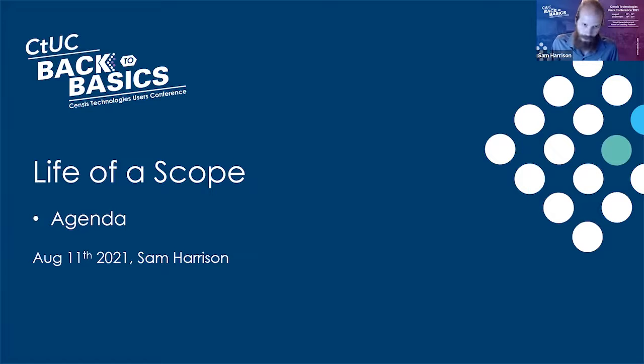We have a few new options of Service Plus this year. In lieu of the on-site training, you can also choose some data options. So there are some new things happening with Service Plus. But anyway, that's what I do.